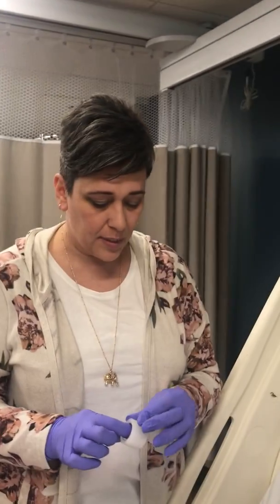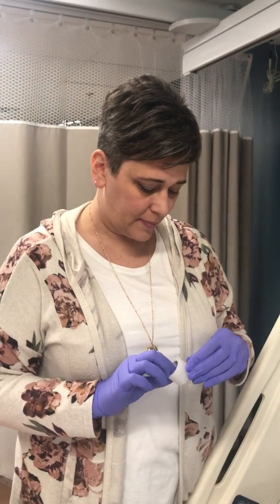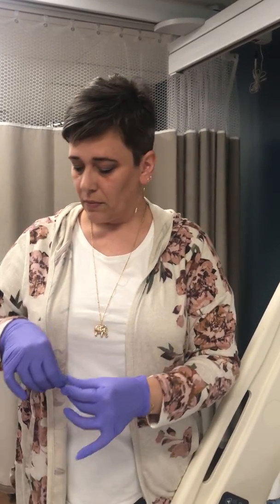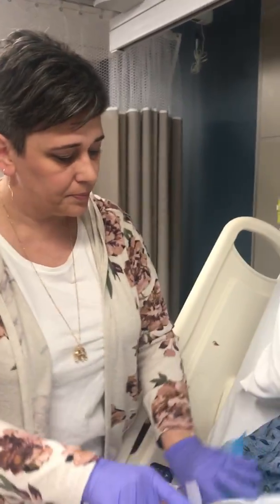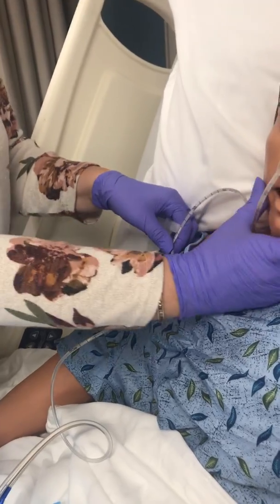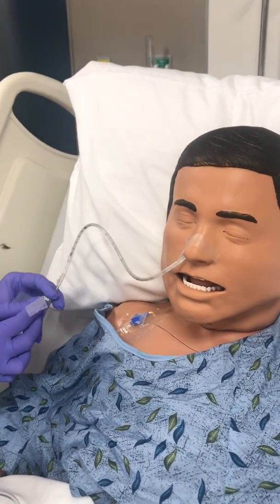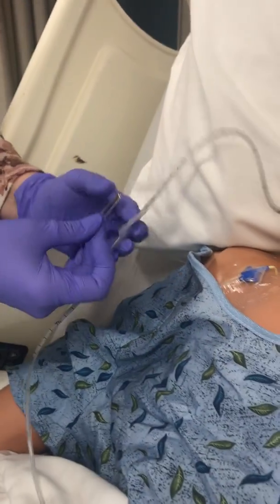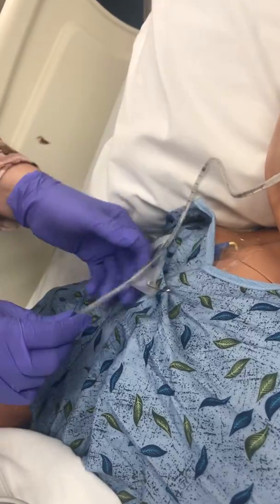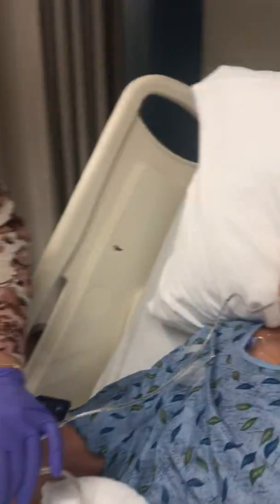I'm going to tape this to the gown — this is something we didn't cover, but I want you to see how it's done. Here's how you secure it to the gown: you want to give them enough room, and you're going to end up pinning it to the gown through a piece of tape. You want them to have enough space to move their head left and right. You do not tape it so tight that they can't lift their head or turn to the side. You put a piece of tape there, then pin the tape to the gown — do not put the pin around or through the NG tube. That way, if the tube gets pulled on, it pulls the gown and not their nose. Send them to x-ray and you're all set.